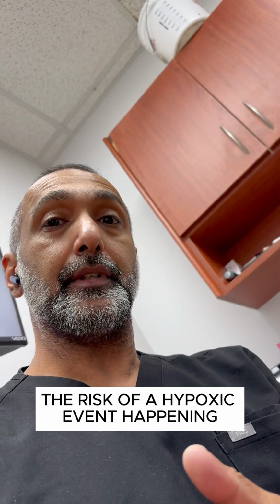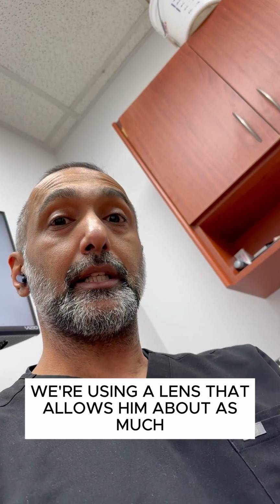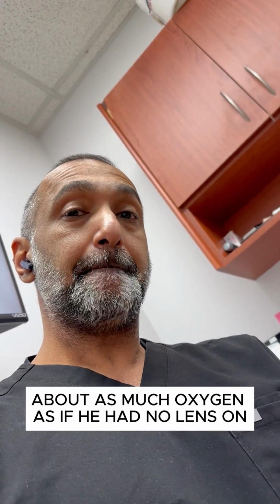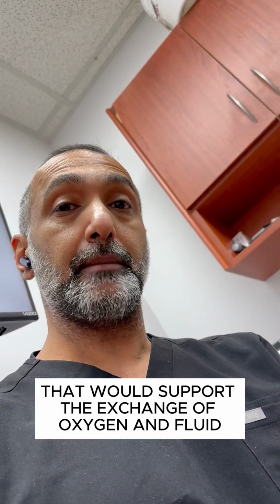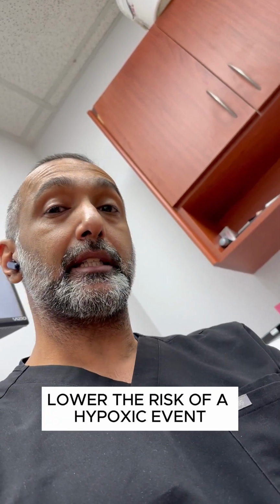The risk of a hypoxic event happening. We're using a high DK contact lens that allows him about as much oxygen as if he had no lens on. We're also going to give him lubricant drops that would support the exchange of oxygen and fluid underneath the contact lens to, again, lower the risk of a hypoxic event.